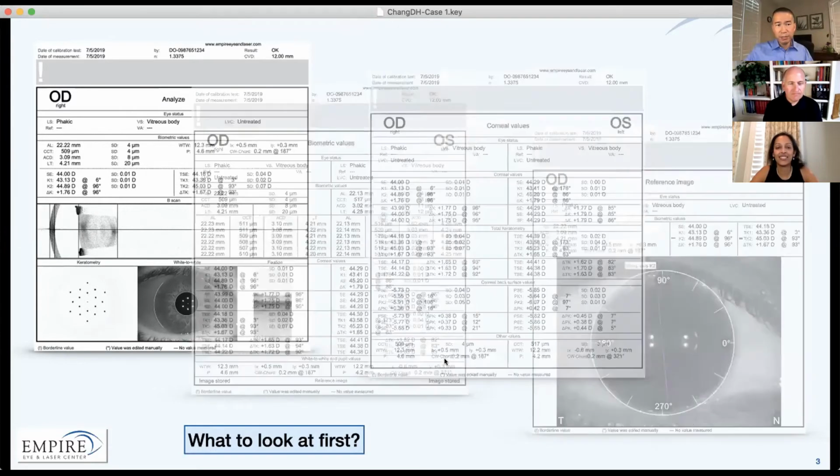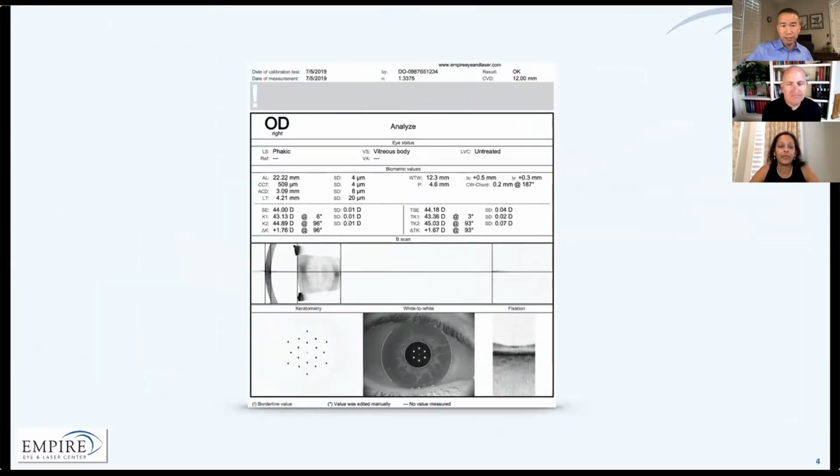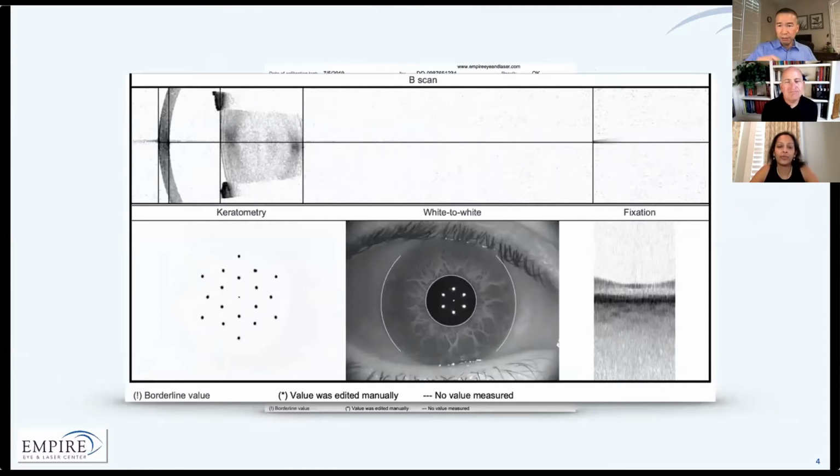What I like to do is basically focus on this particular scan, which is the analyze for each eye. And specifically, I just look at the pictures, just like I said earlier. Sometimes I print, sometimes I don't print. I glance at them, but what I really look at is this eye image. Look at the lens, the reflections, the eye fixation. It takes me just a few seconds to do that. As I'm talking to the patient, I just thumb through it and put my initial on it. Right now, we're still printing. We may eventually get that part digital as well, but it's just a quick scan. And it gives me an overview of what's going on, so it's nice.